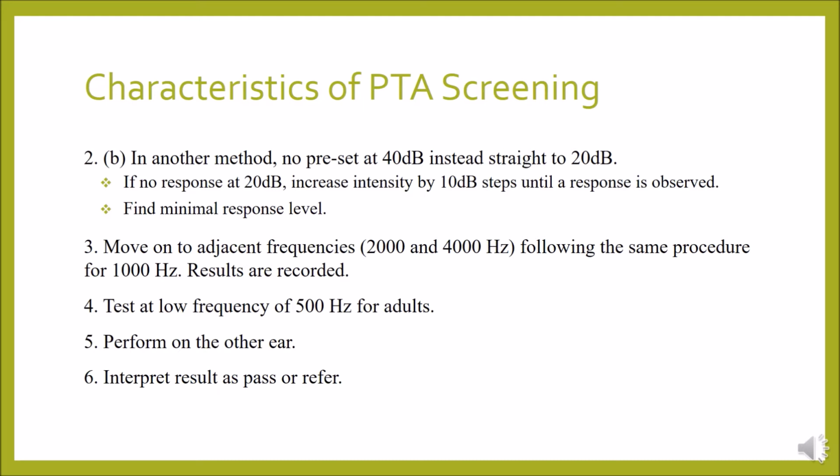As otitis media is common in children, any child who does not pass the pure tone screen is seen during the same session for otoscopy and tympanometry. Children who have normal tympanograms but do not pass the initial hearing screening are suggested to be tested again at another station.